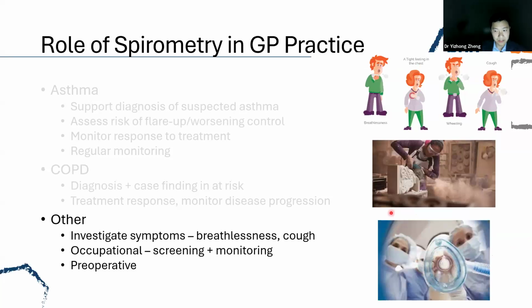Other uses include diagnosis of symptoms such as breathlessness, cough, and wheeze. It may help determine diagnostic and therapeutic pathways and urgency. We use it for occupational screening and monitoring, or as part of a preoperative assessment in terms of determining surgical fitness or guiding perioperative care.